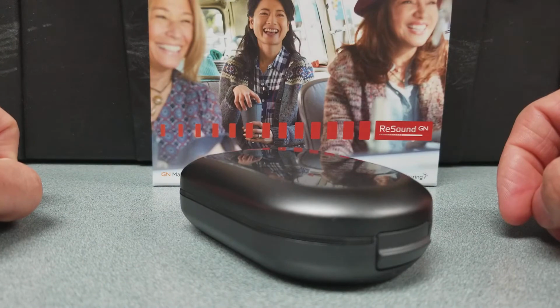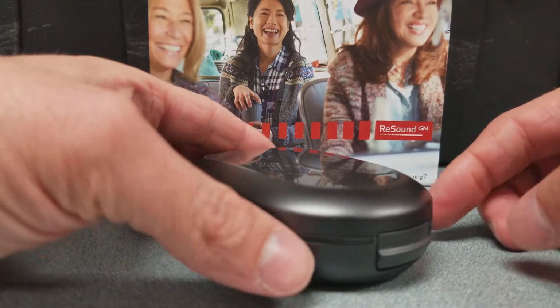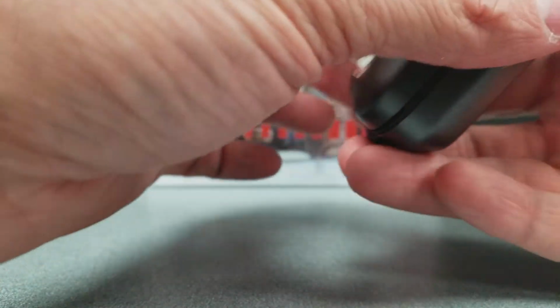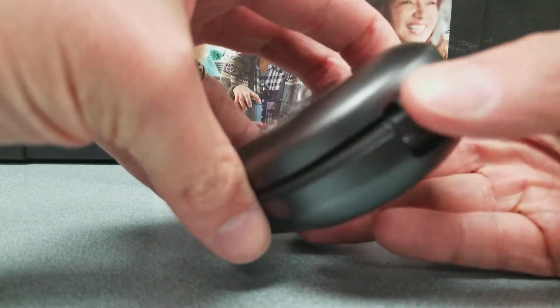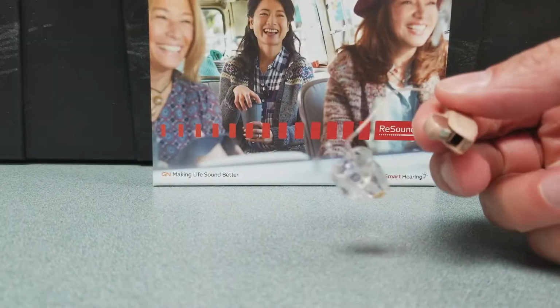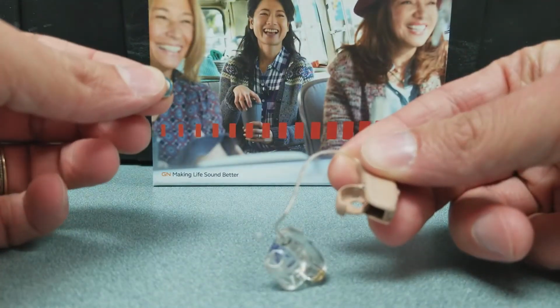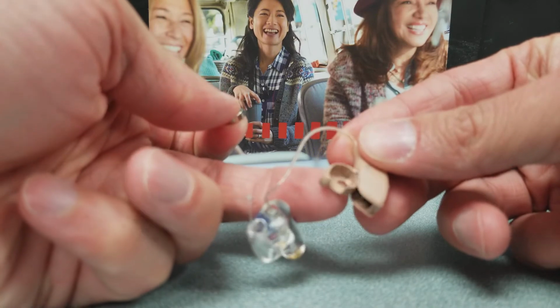We want to keep your hearing aids away from any pets or little ones that may be around, because like any battery in the world, they are toxic if ingested. To open the case, you're just going to push this little latch in and it's going to release the lock. Your battery, when it's time to replace it, you're going to remove it from the side, or you can push through from the back with a pen.